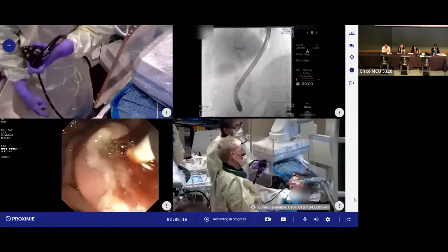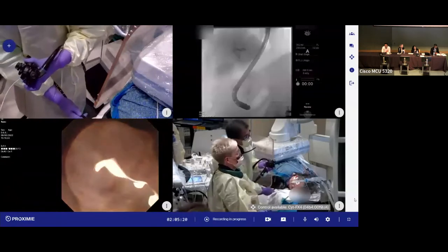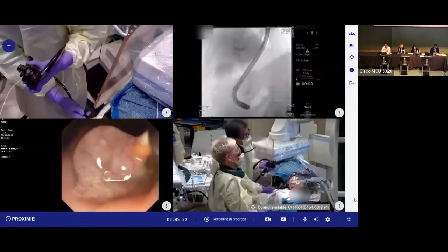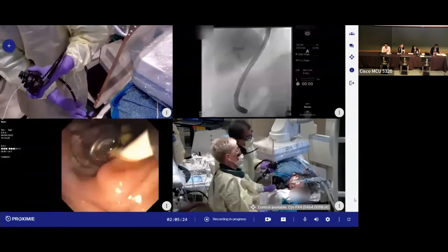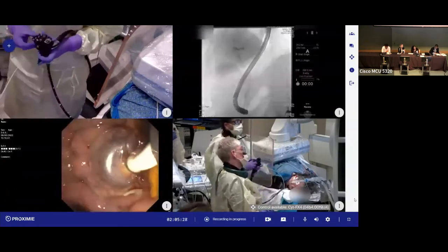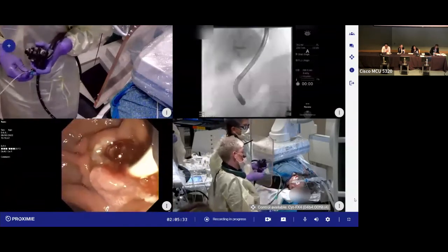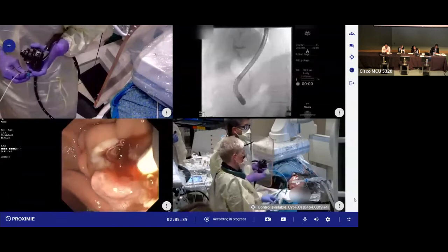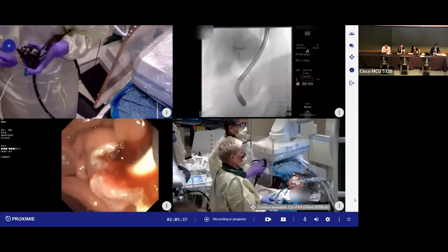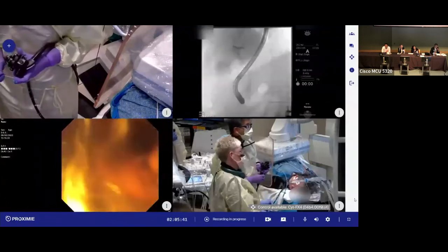Your balloon's up, and it's going to be a gentle push and clockwise rotate, which will then get the duodenoscope tip distal or parallel to the bile duct axis. Yep, it straightens out the axis of delivery. Straight. So as far as, we're just going to try to get multiple stones here. So you go to 9, meaning splitting the stones, not trying to get too many stones at one time.